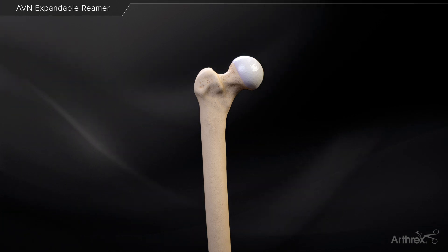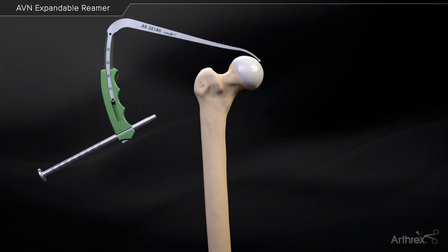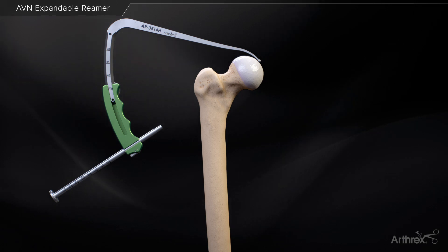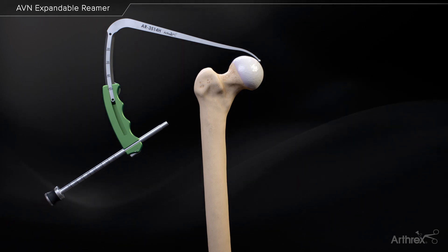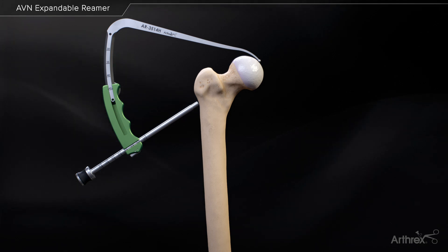While viewing from the mid-anterior portal, place the arthroscopic drill guide through the anterolateral portal with the blunt tip contacting the femoral head in line with the AVN defect. Place the 5 mm drill guide sleeve and the blunt obturator flush against the lateral cortex of the femur, approximately 30 mm distal to the superior tip of the greater trochanter.